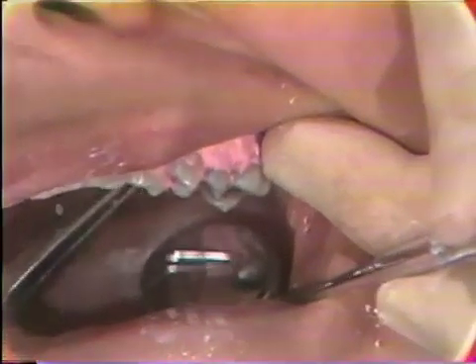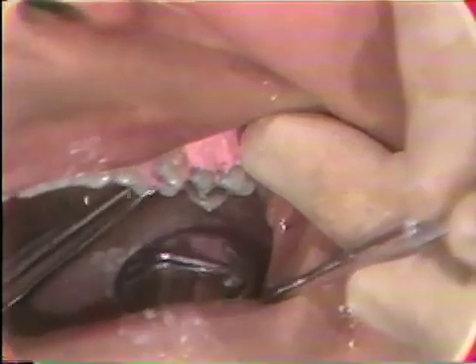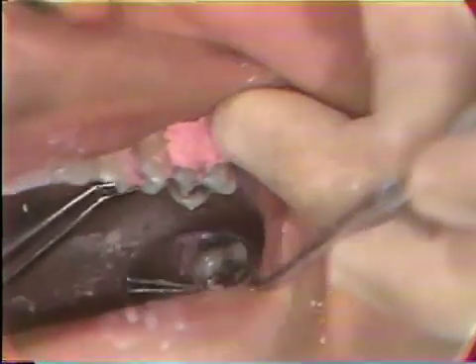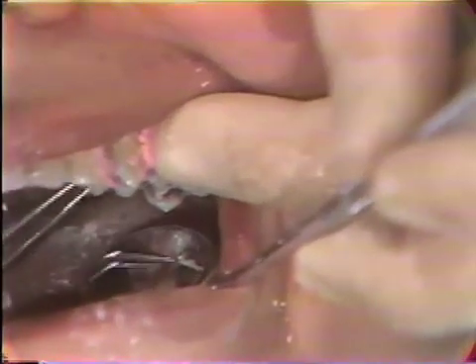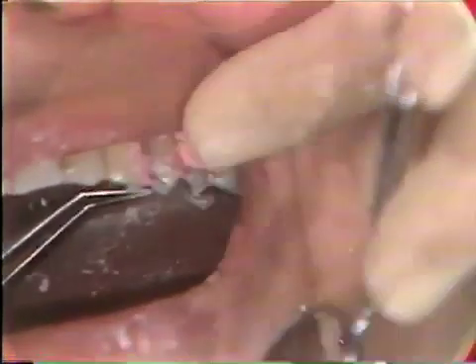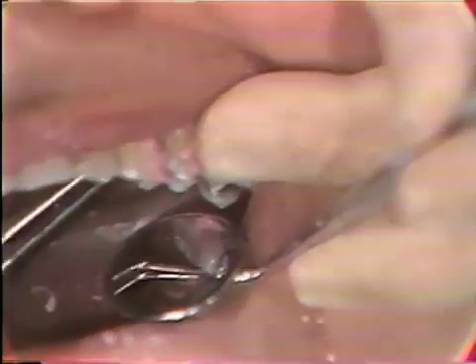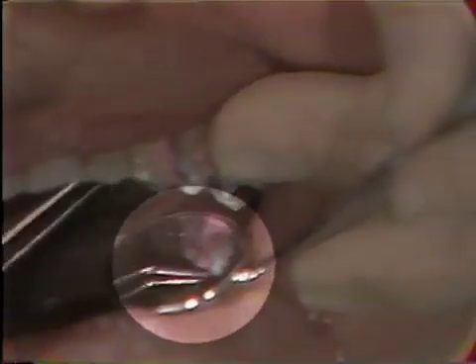On the inside, the same technique used on the buccal is applied. The cotton pliers in a closed position are used to press the dressing material interproximately, pressing it through far enough that it will actually touch the dressing pressed in from the buccal. A finger on the buccal surface is maintained in the same interproximal spot being worked on lingually, so that when the dressing is being shoved interproximately, the buccal dressing is not dislodged. This maintains the mechanical lock interproximately on the buccal while simultaneously acquiring a mechanical lock by pressing the dressing material interproximately from the lingual.